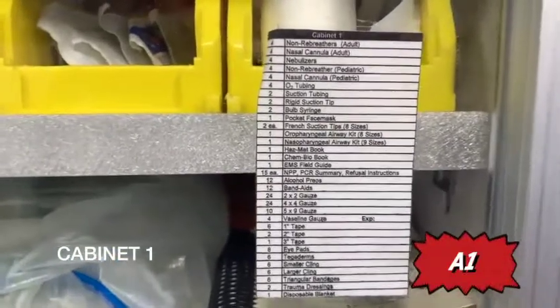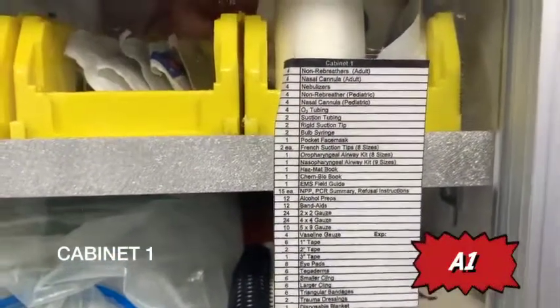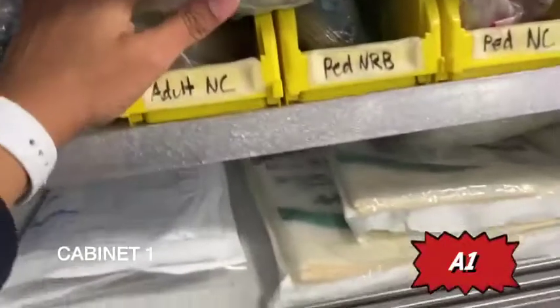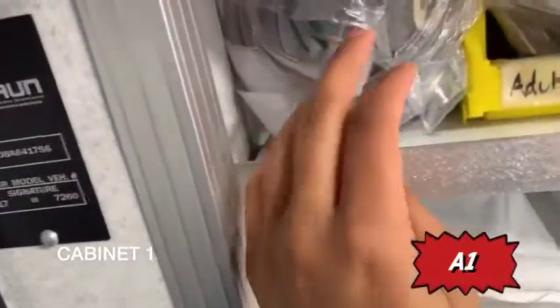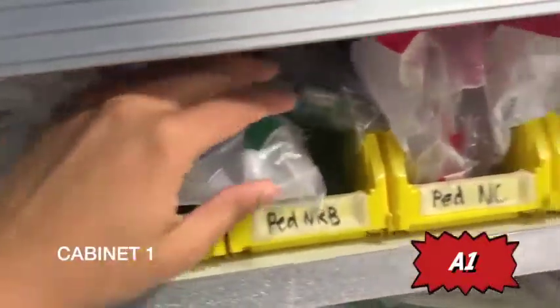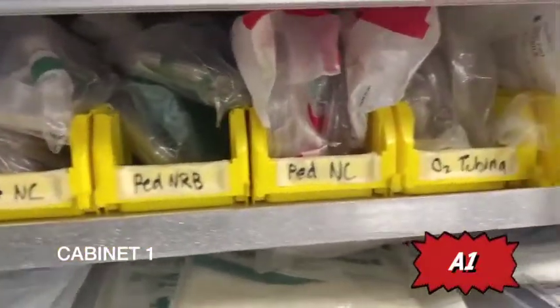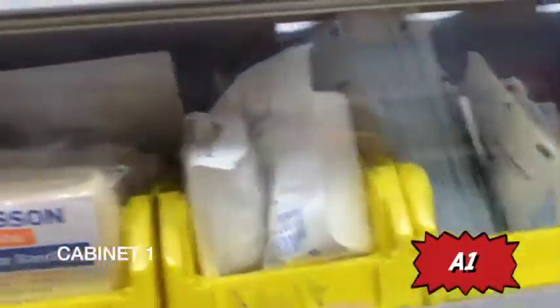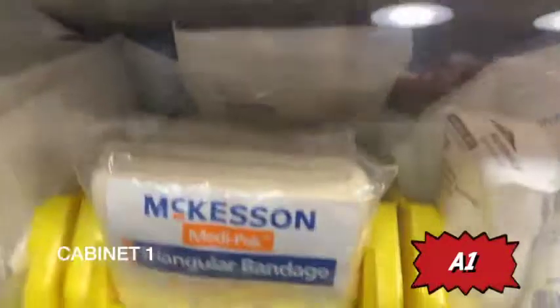Starting with cabinet one — here's a glance of what you should find. This may vary according to the rig check sheet, so you should cross-reference. Everything is labeled really nicely. You have your pediatric non-rebreather, your adult nasal cannula, pediatric nasal cannula, and O2 tubing. Then you have a sterile pad, triangular bandage, and more types of bandages.